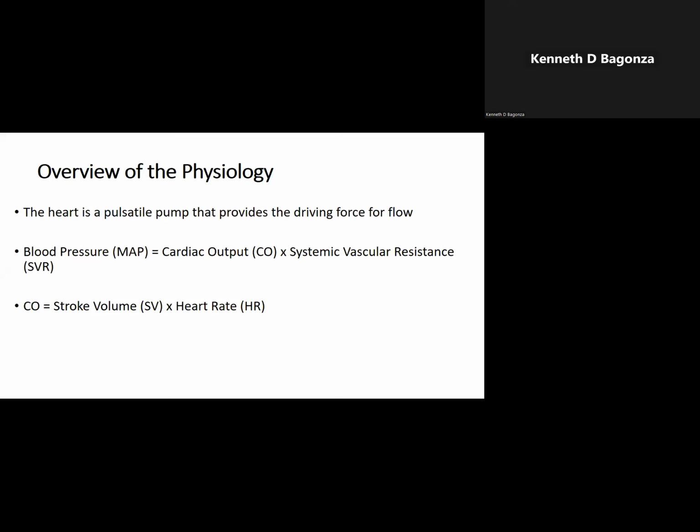And normally we synchronize the delivery of the shock with the R wave in the QRS. So when you look at the QRS complex where the R wave is happening, that's when we deliver the energy. Because if you deliver it outside that, then you might trigger other arrhythmias, and some of those arrhythmias may not be compatible with life, so you can cause a cardiac arrest.